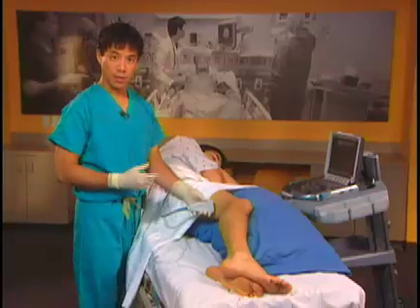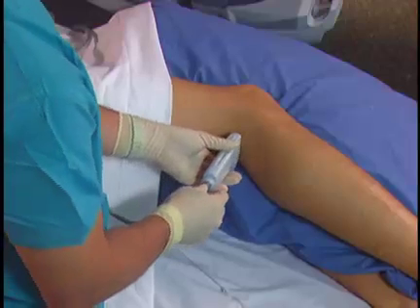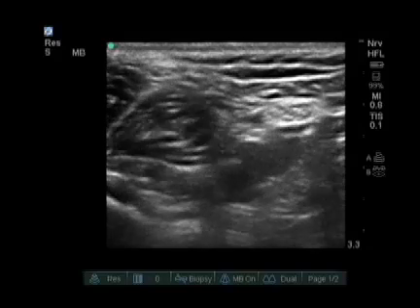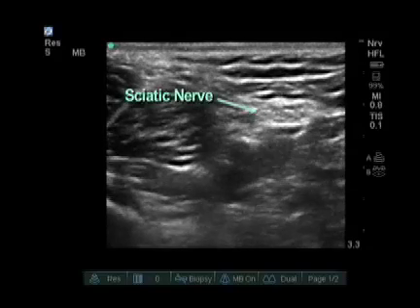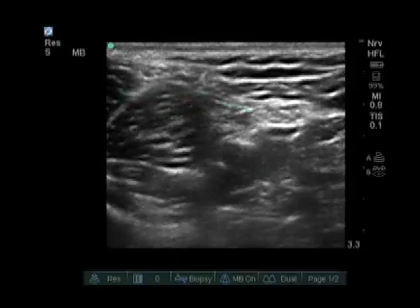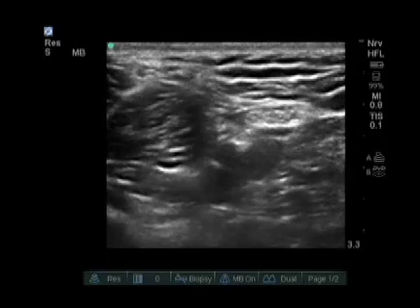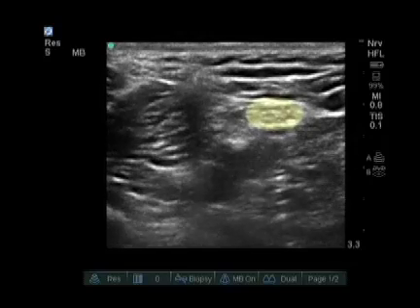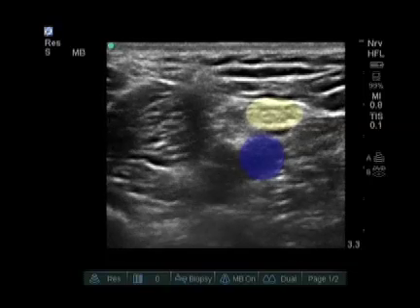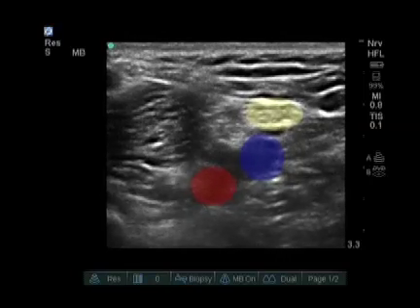To perform the popliteal sciatic nerve block we put the probe directly in the back of the knee. Placement of the probe reveals three structures: the nerve, the vein, and the artery. I call this the snowman in the back of the knee — three circles on top of each other. The uppermost circle is the tibial component of the sciatic nerve, the middle structure is the vein, and the deep structure is the popliteal artery.